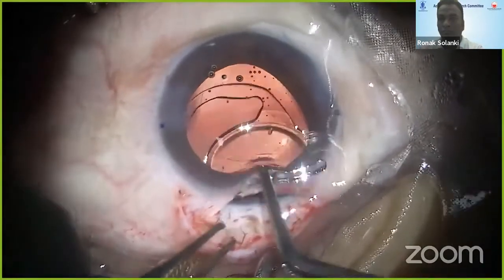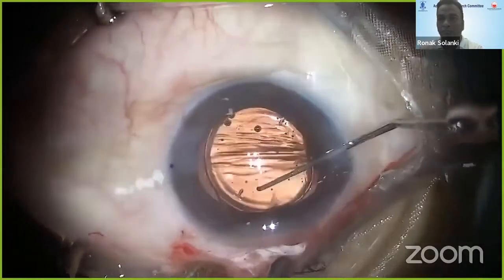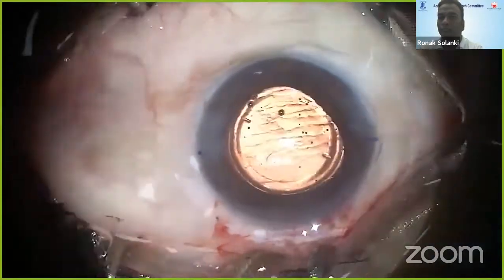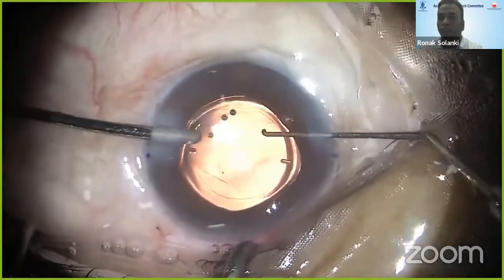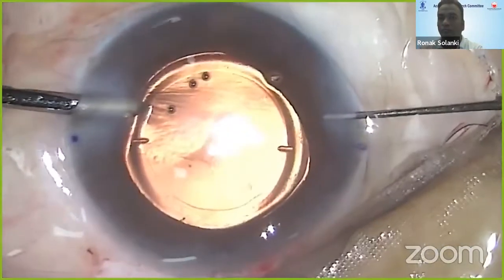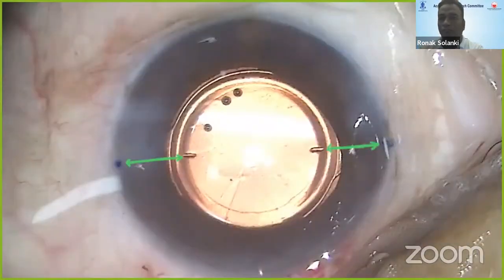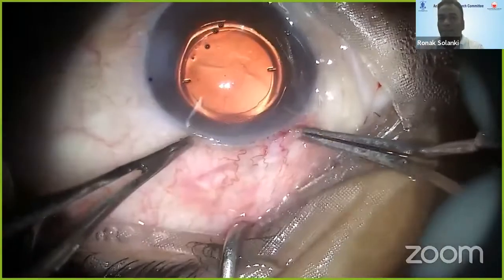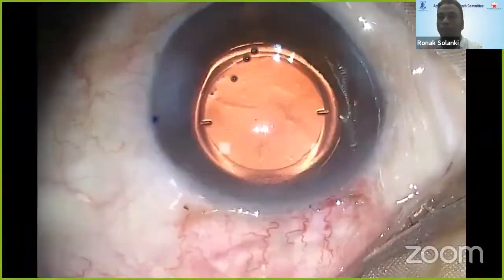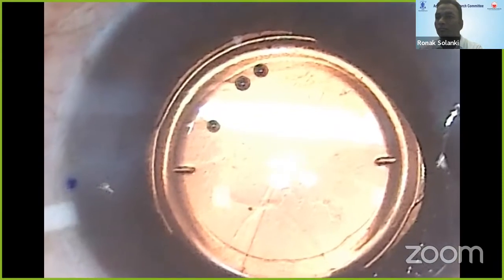A hydrophobic toric IOL is placed in the bag and dialed into position using a dialer. Excess viscoelastic is removed from the bag with bimanual irrigation, and a final toric IOL alignment is done before closing the case. You can see that the toric IOL is well aligned with the 0-180 marks. Wound hydration is done, and the conjunctival peritomy is closed using cautery. You can see the final alignment of the IOL post-surgery.